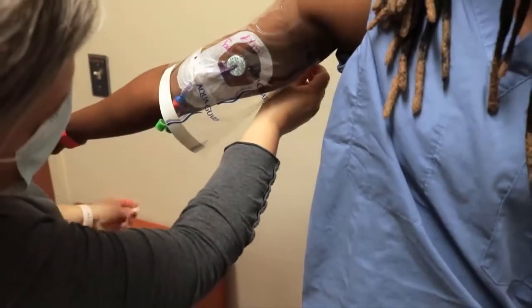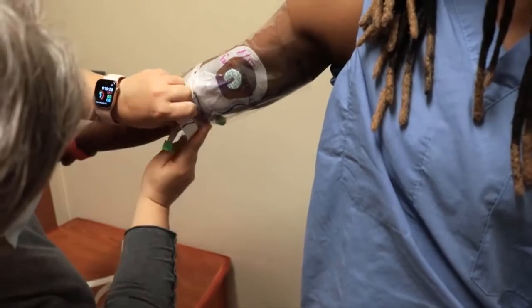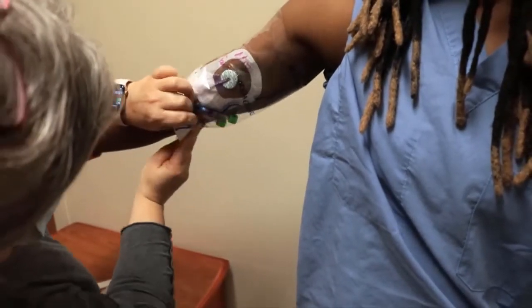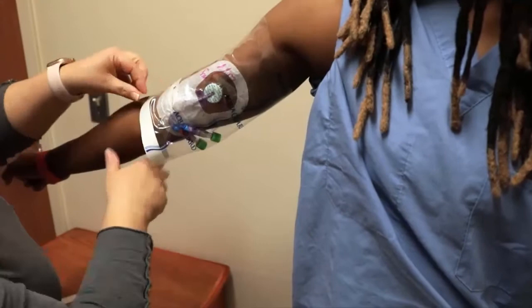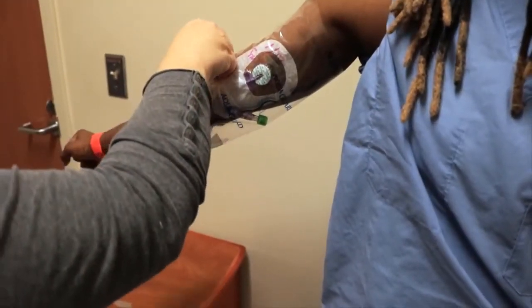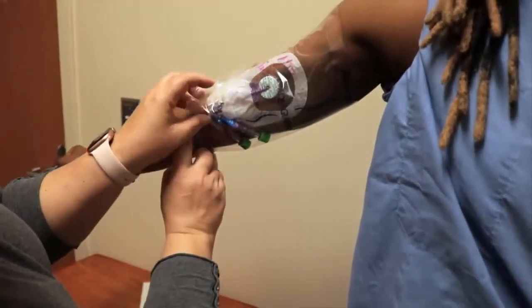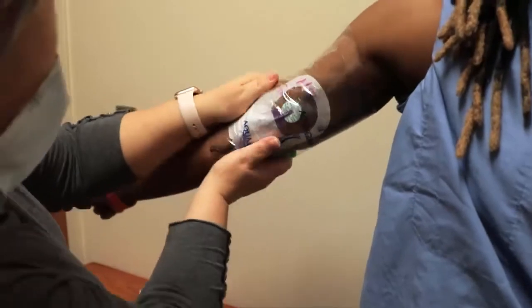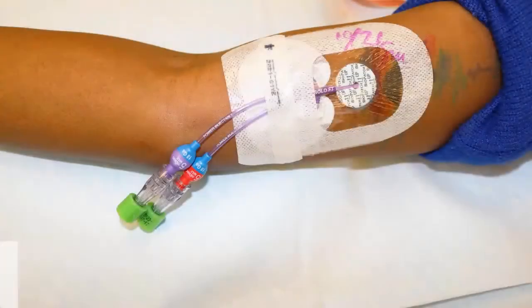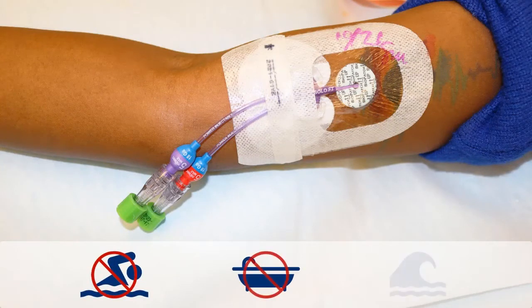You must cover the dressing with plastic when taking a shower and avoid direct water flow to the PICC site. You may use a product such as AquaGuard or Shower Shield, which can be purchased at local medical supply stores or online. You may also use press and seal or saran wrap, available at your local grocery store. You cannot swim or soak in a bathtub, pool, hot tub, ocean, lake, river, or sauna while the PICC is in your arm.